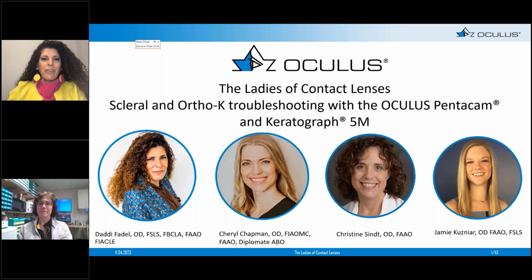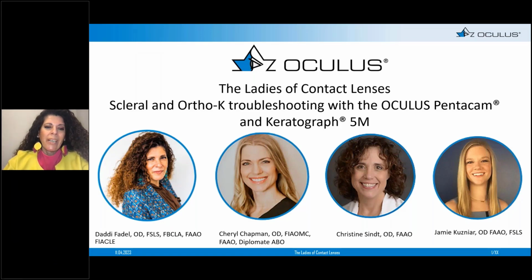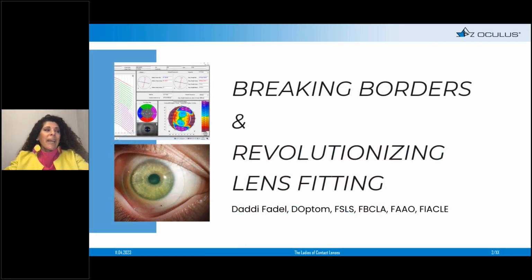Dr. Fadel? Thank you for the introduction and thank you for having me. Okay, so we've been using technology to customize contact lenses for years now, and we noticed that what we were customizing is the patient's care, not only the contact lens design, because technology allowed us to better educate our patients through photos, topographies, graphs, and lens designs, and all these features allow us to ameliorate our communications with patients, increasing empathy and compliance, and consequently, lens fitting success was improved as well.